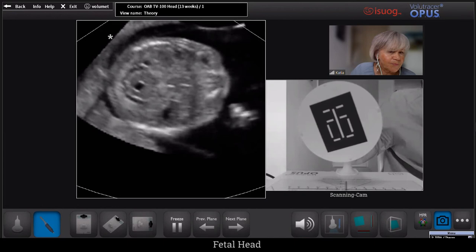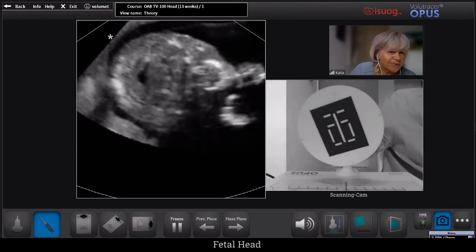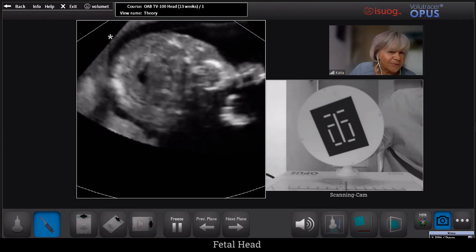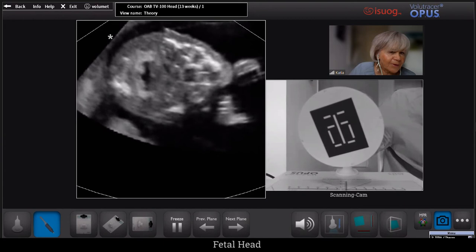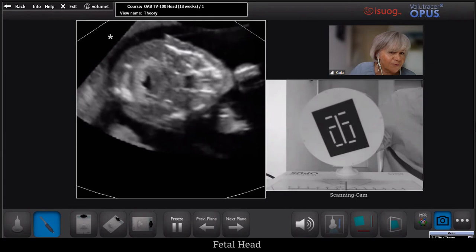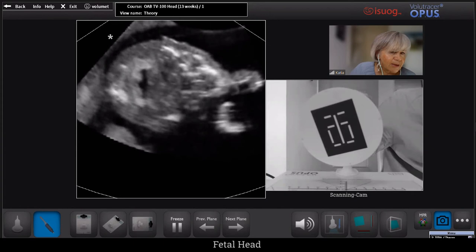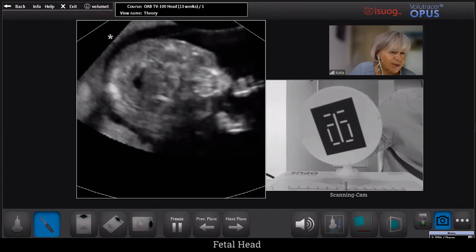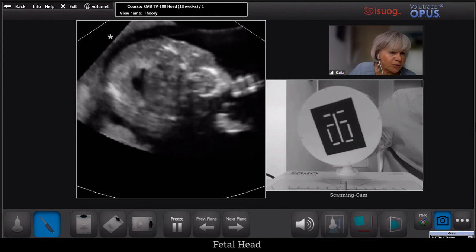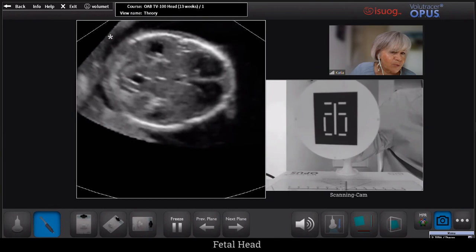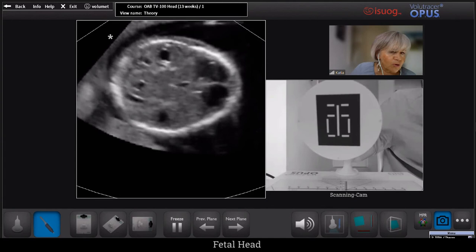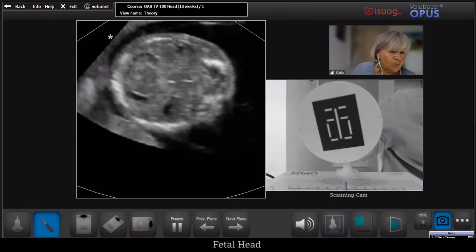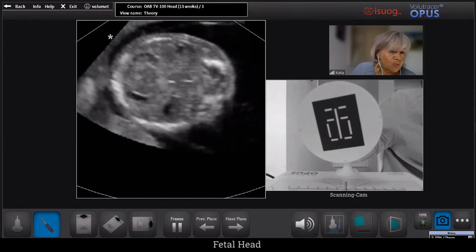If we go even more to the back of the head, we will find the cerebellum. We will also find the fourth ventricle — you can see that black structure there — which is lined by the choroid plexus of the fourth ventricle. We see that there is a communication between the fourth ventricle and the cisterna magna, where we see an interruption of the white lining of the choroid plexus. So with very few movements, we have been able to investigate a lot more of the fetal brain anatomy than we would traditionally have done in the past.